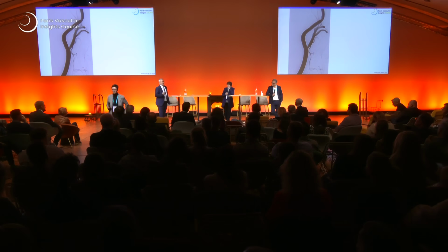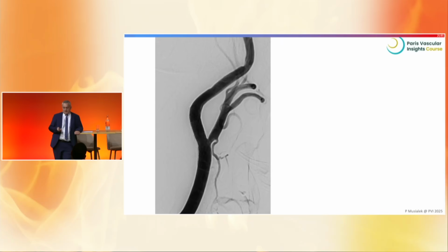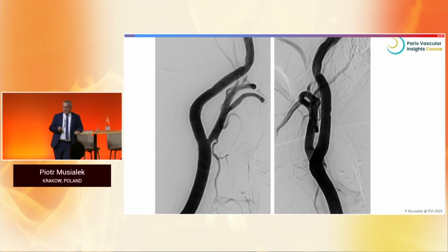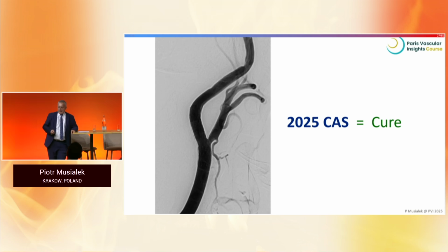If this was a thrombus-containing plaque, we would have used proximal protection. We may have some problem now because MoMA is not going to be available soon, totally. But this is what the result is. In this other projection, we believe full endovascular reconstruction was enabled, I believe, with the past experience of not being able to fully optimize the stent if I did not prepare the plaque, following the coronary strategy of plaque preparation and optimized stent post-dilation.